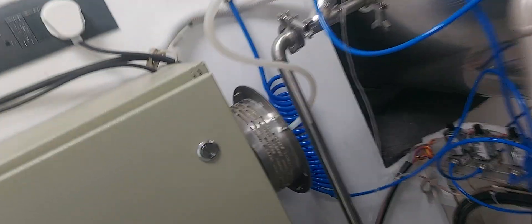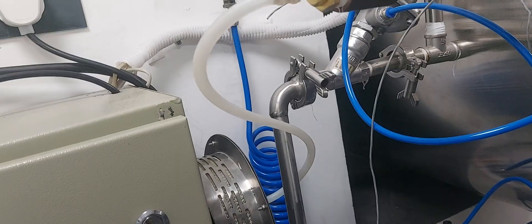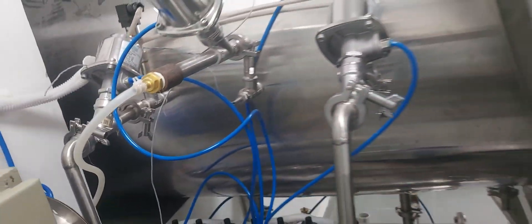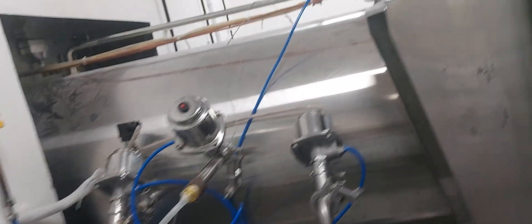We have our customized HEPA filter system. Normally, steam sterilizers don't have HEPA filters, but our HEPA filter is a customized design — it gives you completely clean air after the sterilization and drying cycles.